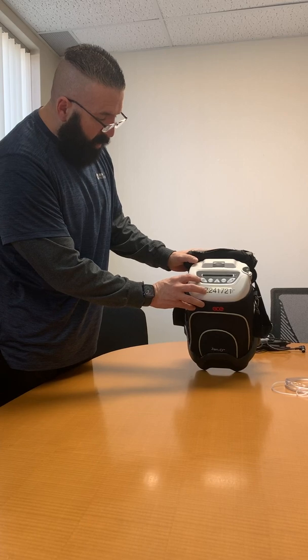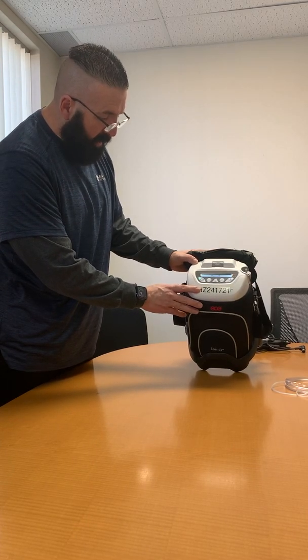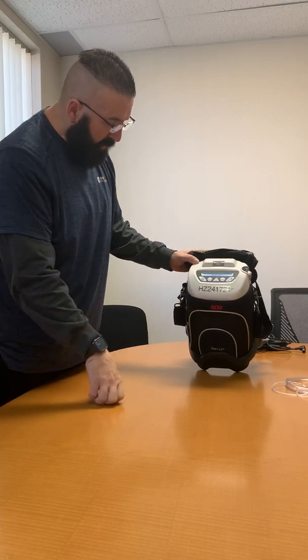So the very first button we have right here is going to be your power button. You're going to press that power button on. It's going to light up. It's going to have the name Zen-O. We're just going to wait for that to start up.